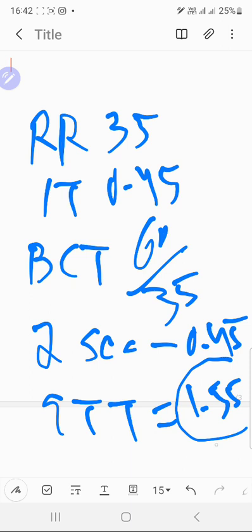So in obstructive diseases, especially cystic fibrosis or asthma, sometimes you have to decrease respiratory rate to get better CO2 clearance, because once you decrease the respiratory rate, the breath cycle time gets longer and you are giving more expiratory time. So you are giving more time in a respiratory cycle for CO2 clearance. I hope you guys will understand.